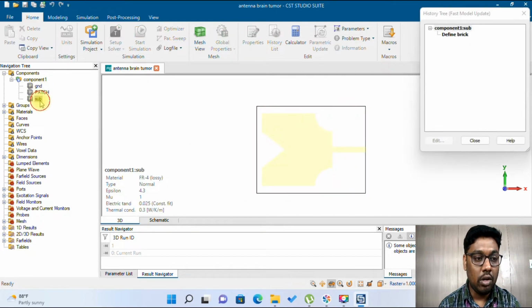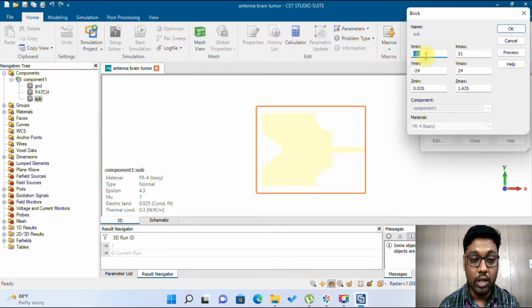The total surface area of this antenna: the x-axis value is 31 to 31, so it's around 62 millimeter. That's the width of the antenna, and the length of the antenna is 24 to 24, around 48 millimeter. So 62 of width as well as 48 of length is the dimension of the total surface area of this microstrip antenna.